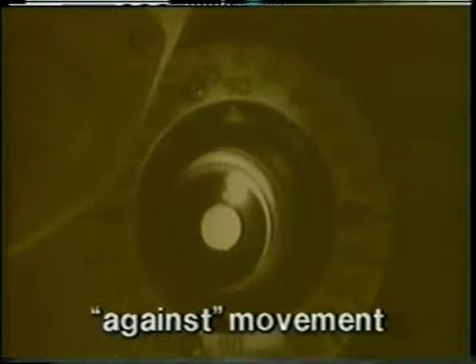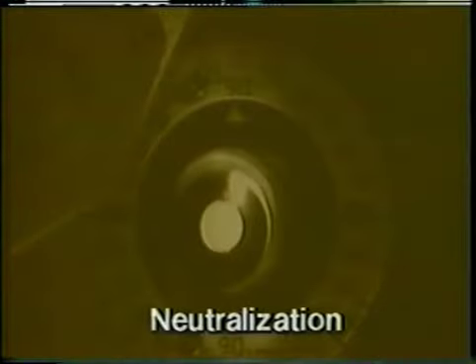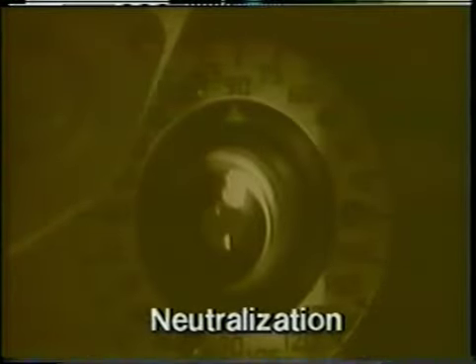Only small sweeps are necessary, just enough to detect the direction of movement of the reflex. Notice that this reflex moves in the same direction as the intercept. This is called with movement. In another situation, we may see this reflex, one which moves in the opposite direction to the intercept. This is called against movement. At the point of neutralization, the reflex looks like this. It doesn't move at all. The pupil suddenly fills with light as the intercept crosses it.